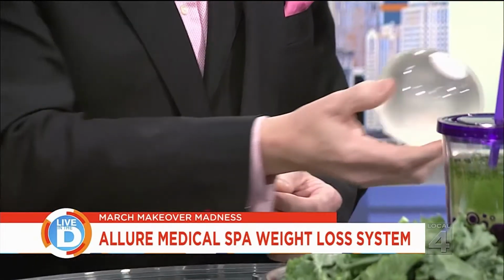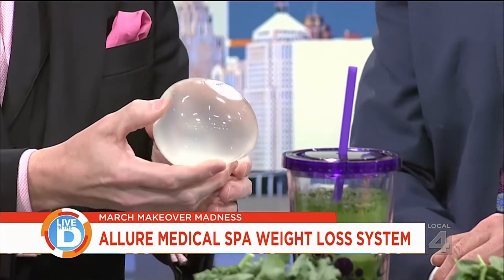Okay. So even though it was just FDA cleared in the United States 6 months ago, it's been around the world for over 20 years. Over 250,000 of these procedures done before. So what is it filled with? Saline. Okay, not chocolate. I know. It's amazing. Not in this case.